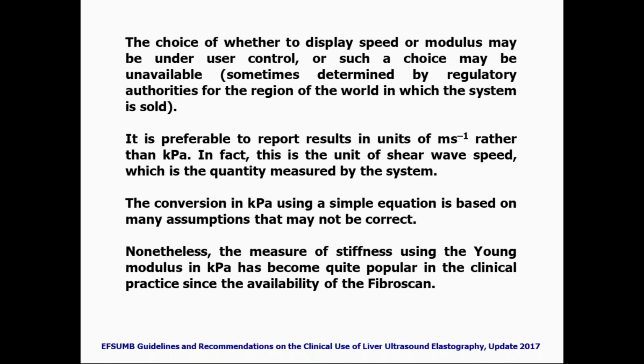From a technical point of view, it is preferable to report the results in meters per second rather than in kilopascal. In fact, this is the unit that the system quantifies, the velocity of the shear waves. The conversion to kilopascal using a simple equation is based on many assumptions that may not all be correct.